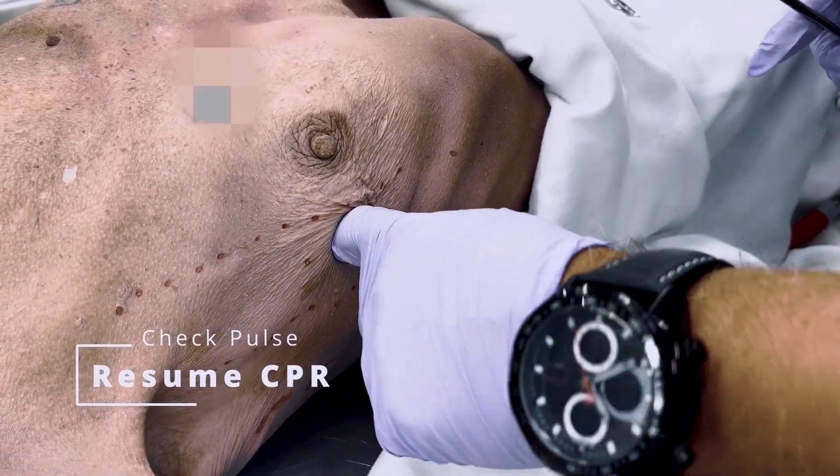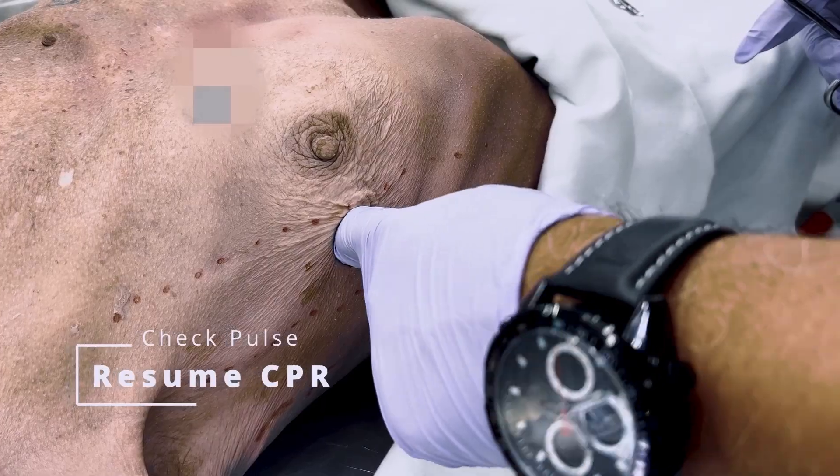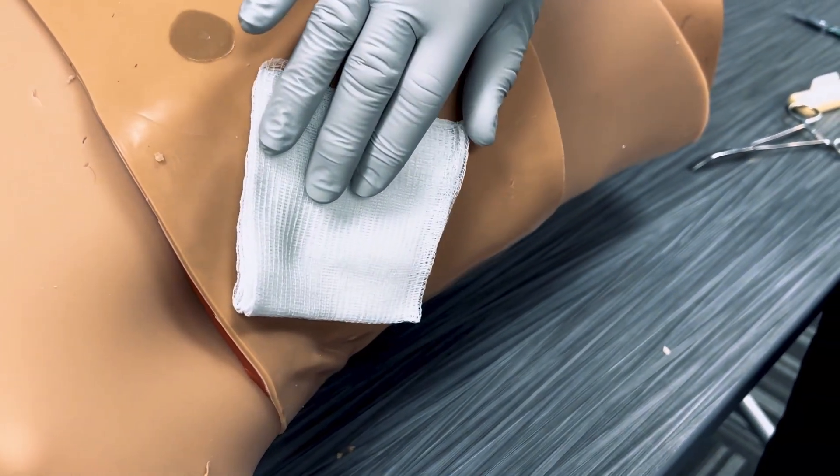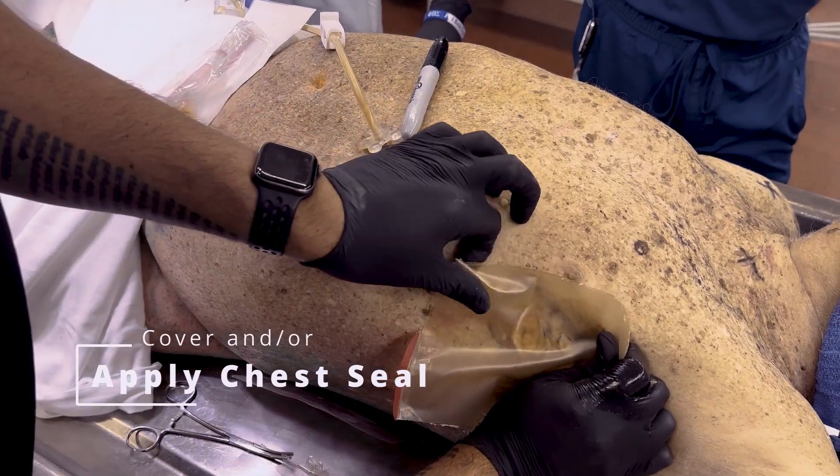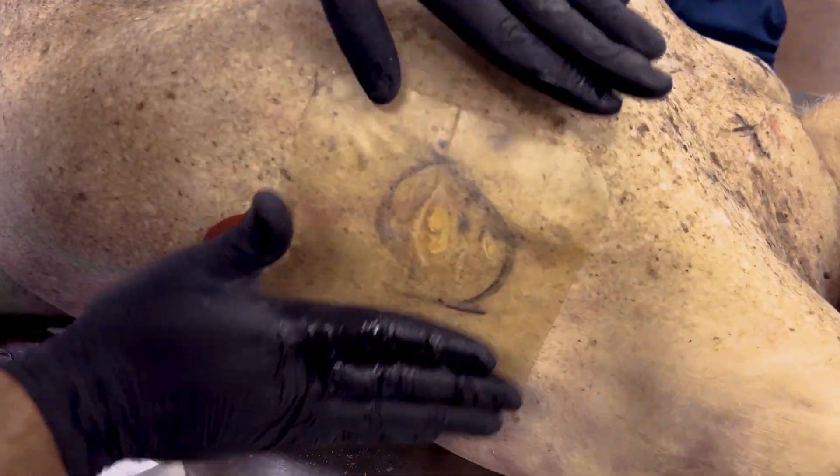Check your patient for a pulse and resume CPR if necessary. Loosely cover the site with a 4x4 gauze. If ROSC is achieved and the patient begins to breathe spontaneously, apply a chest seal.